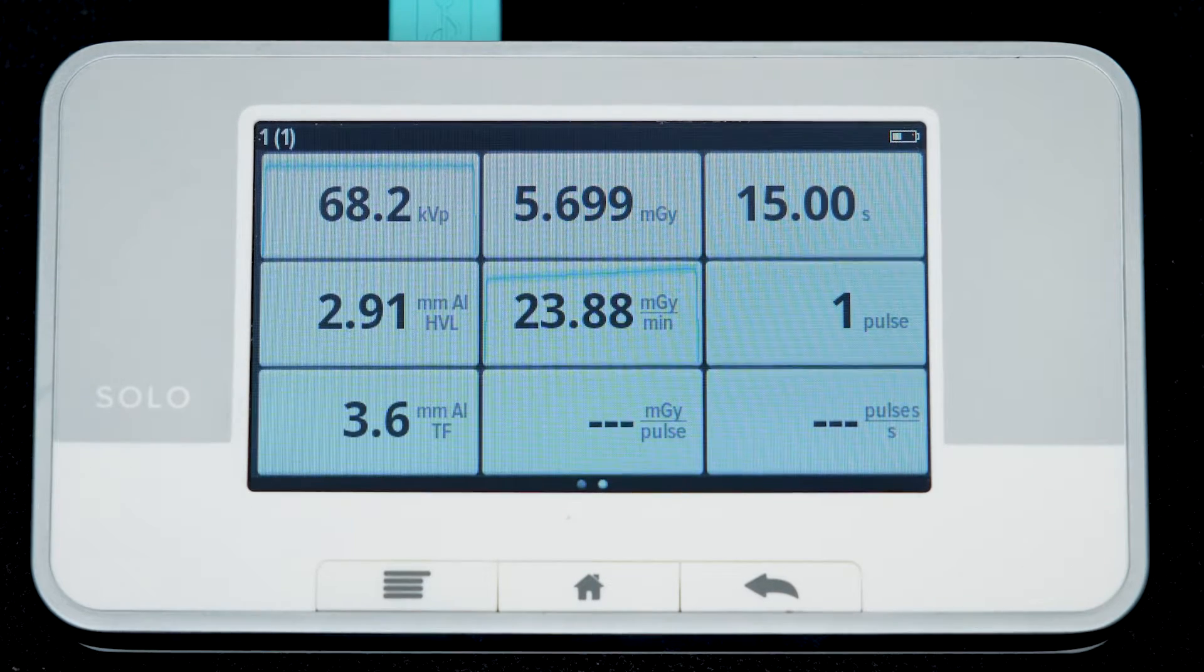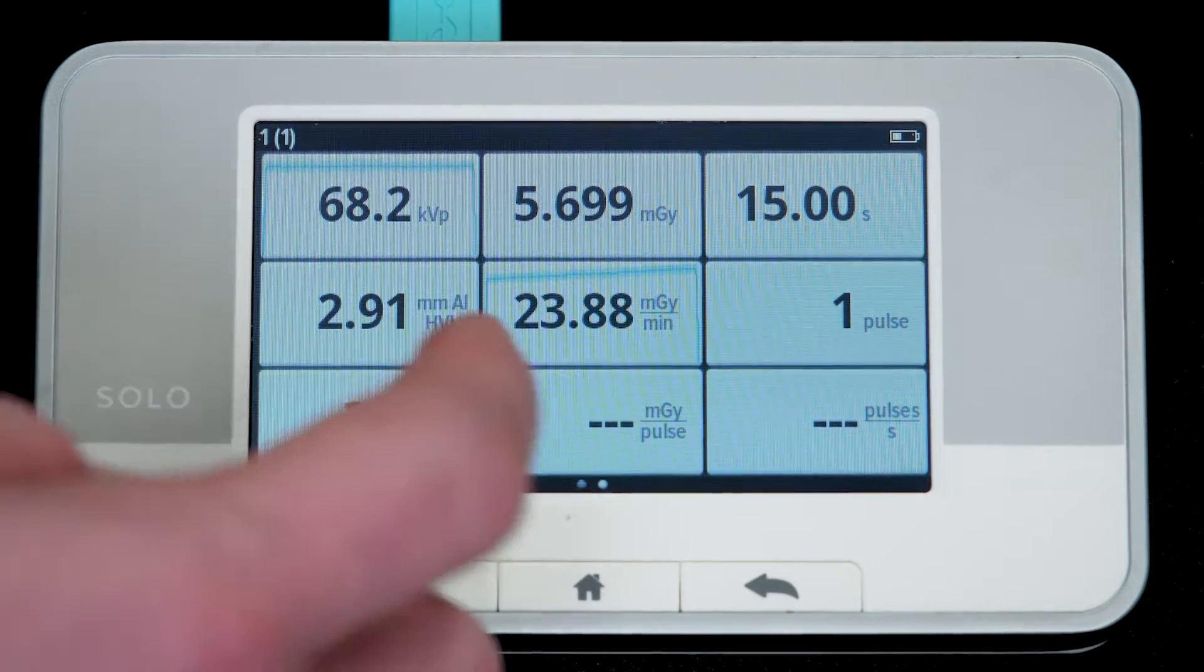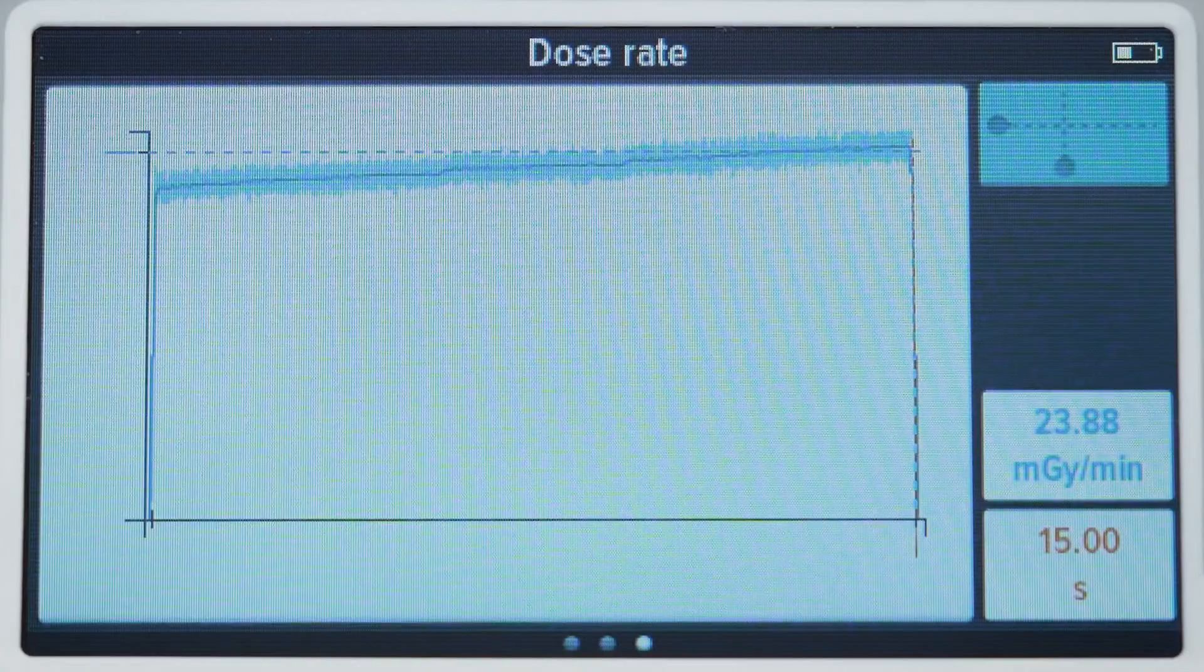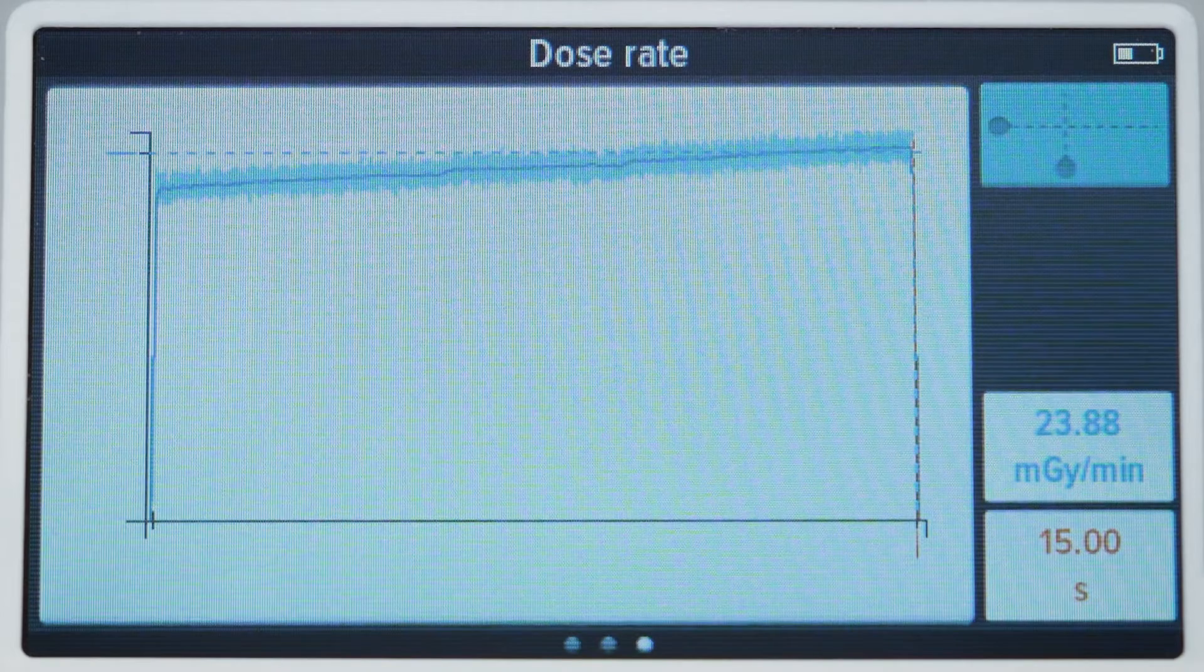On some machines, the dose rate can be an indication of the position. The dose rate value is found under the dose value on the base unit. Tap it and swipe left to see the waveform. You can see that it is leaning slightly, which is another indicator that the sensor is not perfectly centered in the X-ray beam.